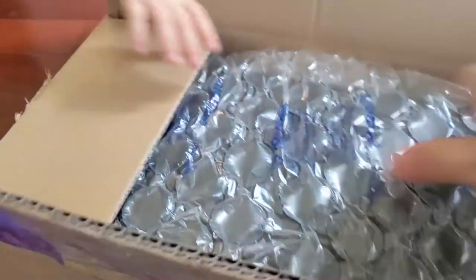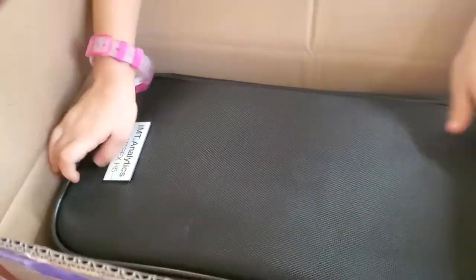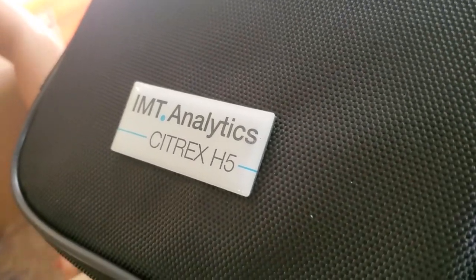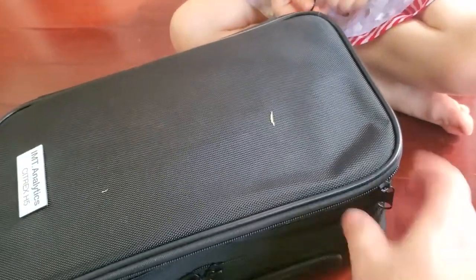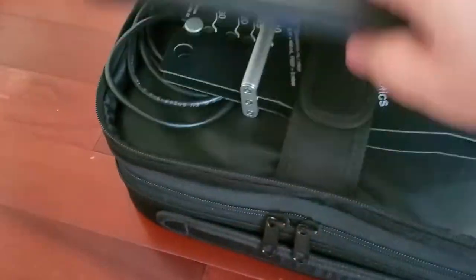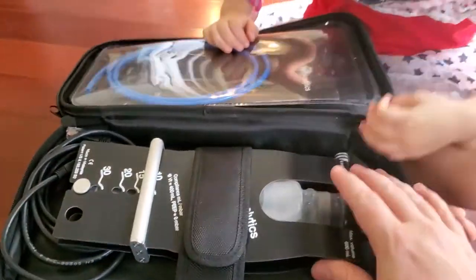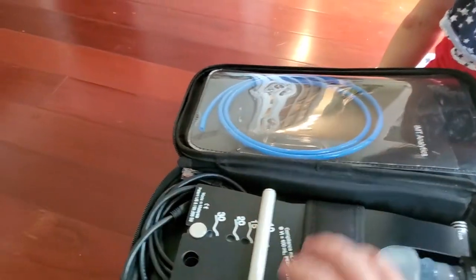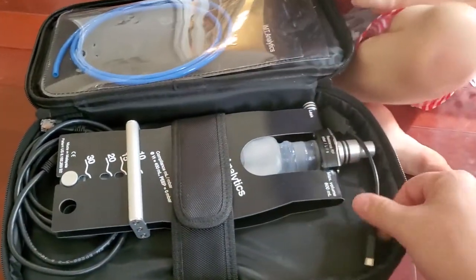Oh, what a nice case! IMT Analytics Citrex H5. Okay, let's put this over here — help me. Let's open up, here are the zippers right here. Okay, ready? And then this one goes on this side. Oh, look at that — there's a test lung. Let's not pull anything out. We've got our pressure hose. Oh, what a nice kit — I really like the way this is set up.